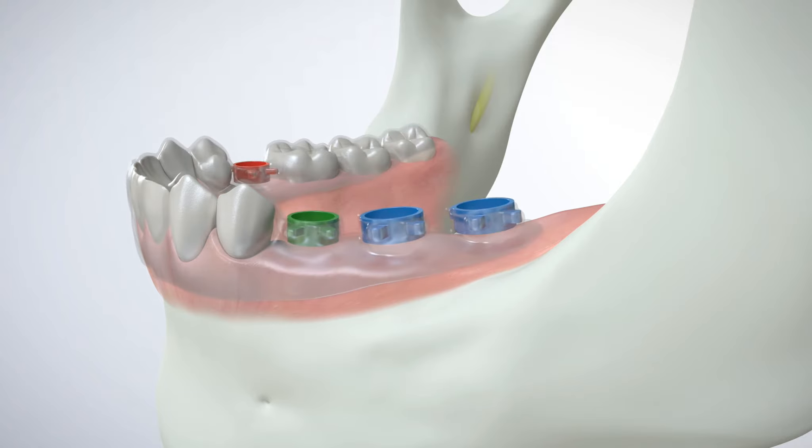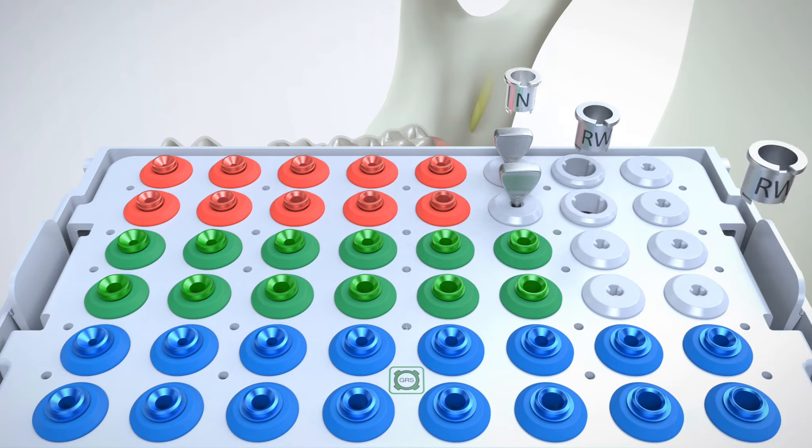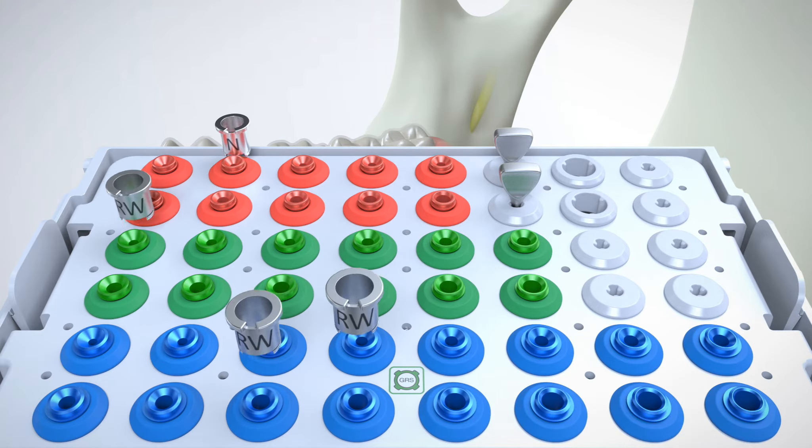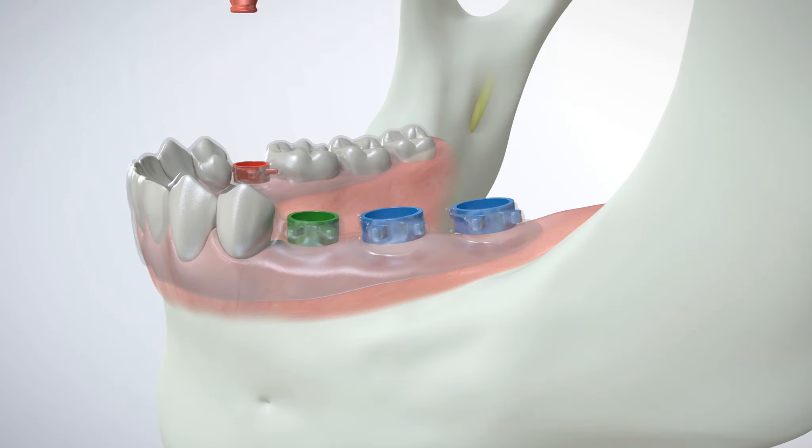GRS Guide System — multiple surgical sites. A single GRS surgical guide can be used for implant placement in multiple surgical sites. Depending upon the implant type and platform, several GRS drill sleeves with the same or different diameters are removed from the cassette using GRS IR tools. The drill sleeves are then snapped into the surgical guide, and the IR tools simply separate from the drill sleeves using a sliding motion.